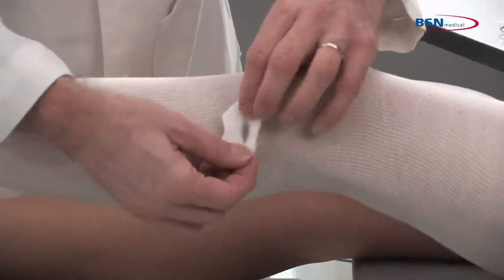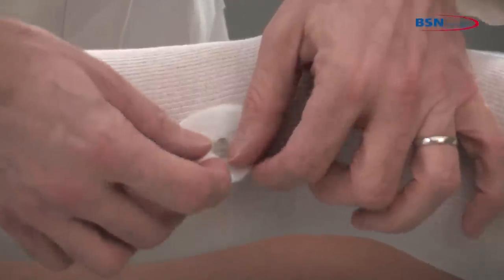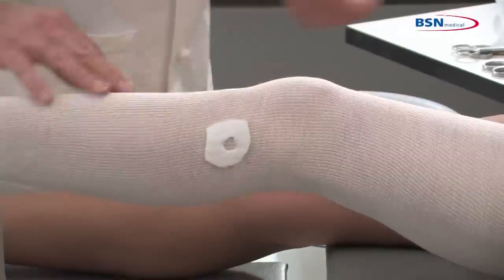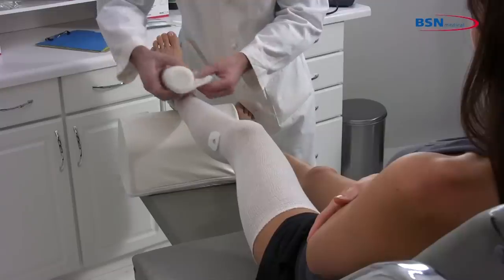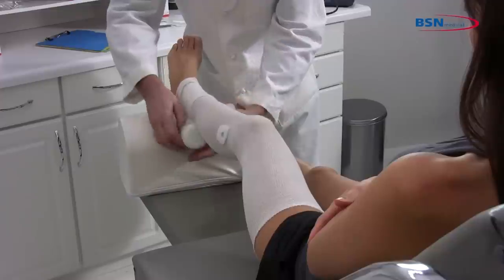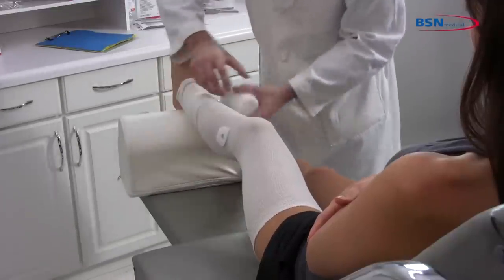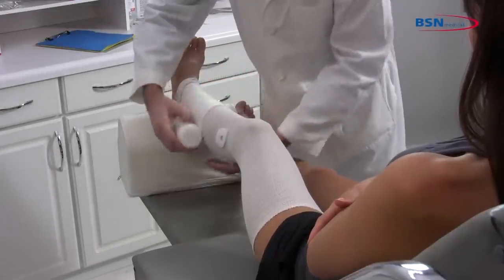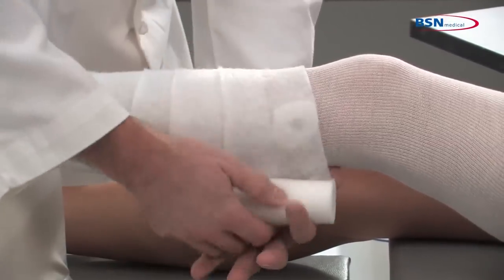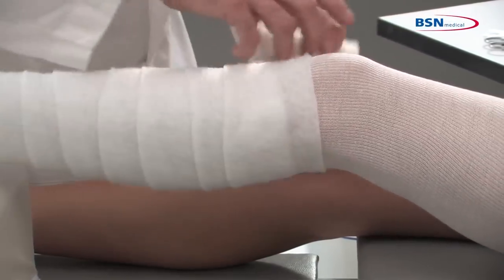Adhesive felt or foam can be used to provide additional padding over bony prominences like the fibular head. Apply 3-inch, 4-inch, or 5-inch padding starting above the malleoli and apply with 50% overlap toward the pelvis. Applying with a slight tension will allow the padding to lie smoothly and have a snug fit.